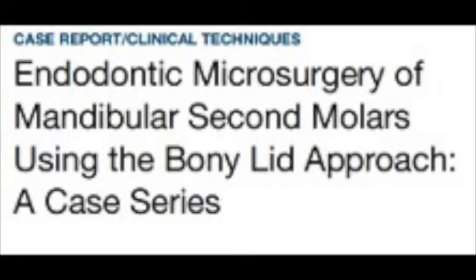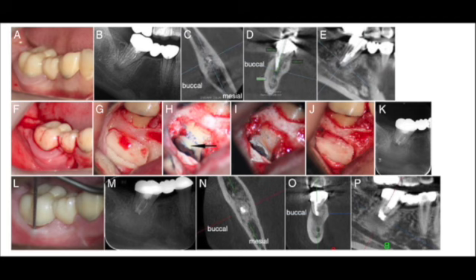The Bony Lid, or the bone window technique, is the use of thin osteotomy instruments to cut and remove an intact cortical bony lid, which acts like an autologous graft for the surgical site, and this piece will be repositioned to the original site at the end of the procedure. Also, they mentioned that this procedure will provide better visibility of the operation field and it will minimize bone loss.